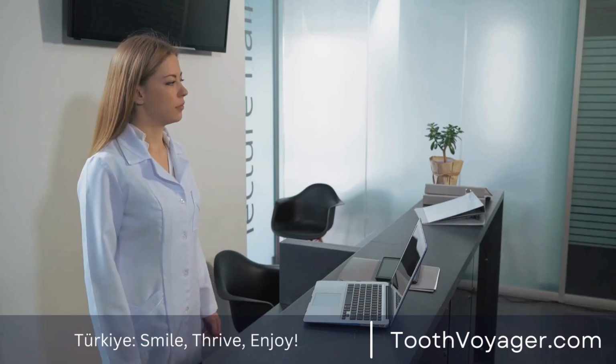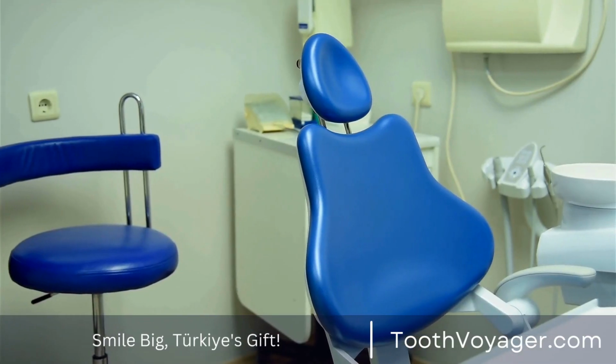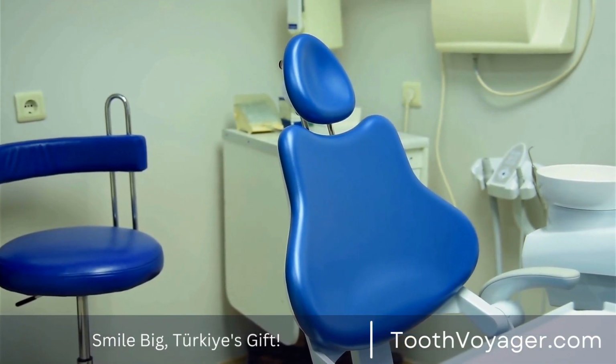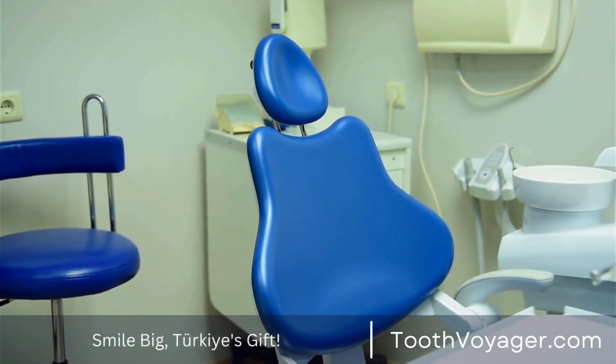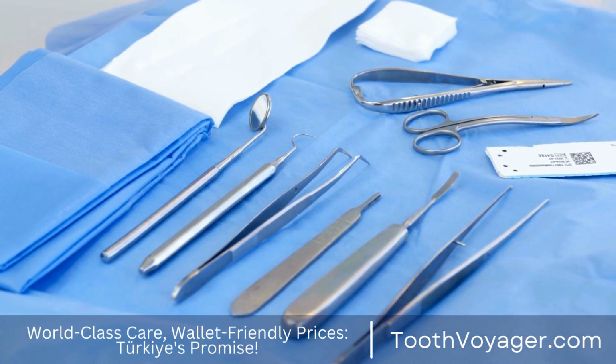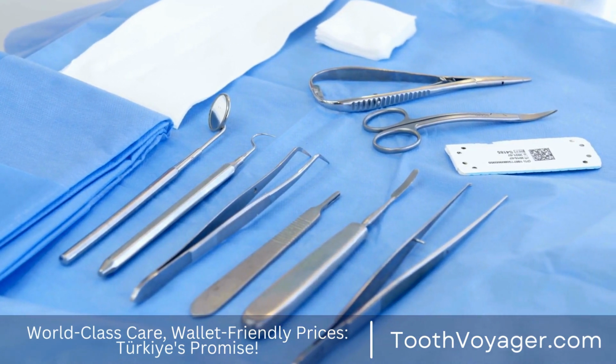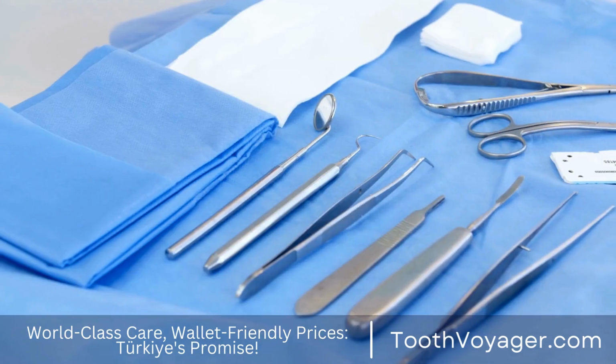3. Dental crowns can protect weak teeth. Dental crowns can be used to safeguard weak teeth against further decay or injury. When a tooth has become damaged by decay, an extensive filling, or even a root canal, a dental crown can help make the tooth stronger and more secure and stop it from fracturing or breaking.